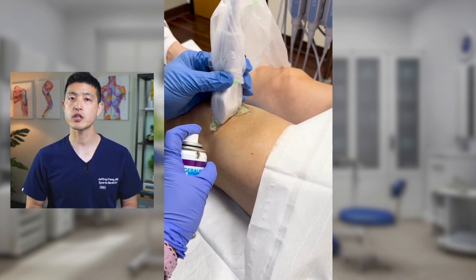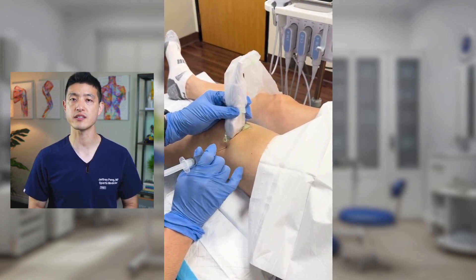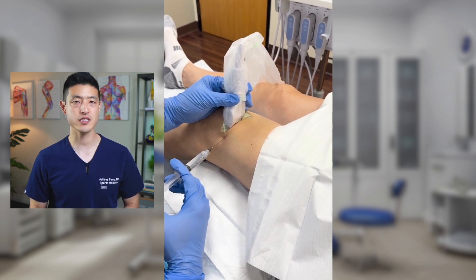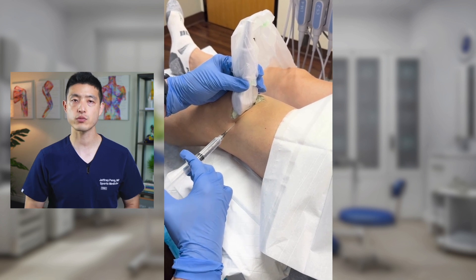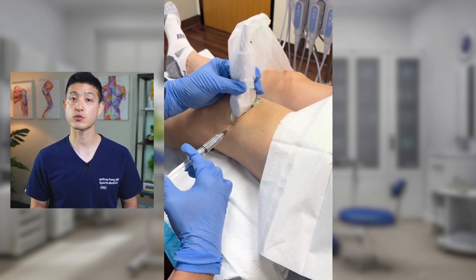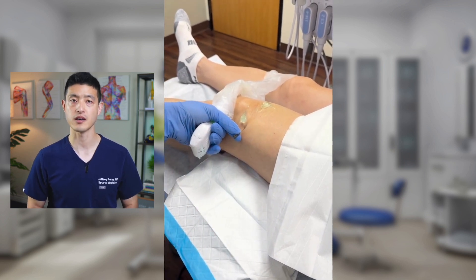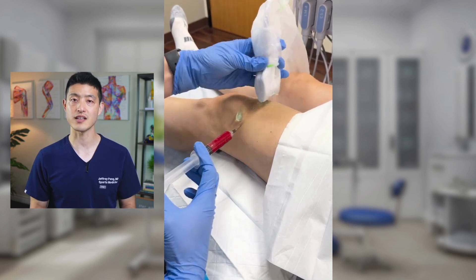Then, same thing, we go in with the 22-gauge needle and administer just a little bit of ropivacaine underneath the skin. You can see me use the ultrasound and make slight adjustments to ensure the needle is in the right spot before switching the syringe to the PRP. Now, this knee didn't have any swelling in it, so nothing to aspirate here — we can just go straight to injecting the PRP. Once the PRP is in, everything's done. Start to finish, again, less than two minutes.